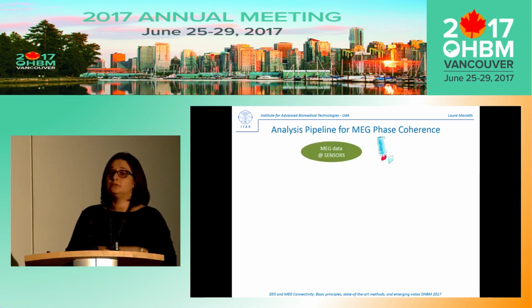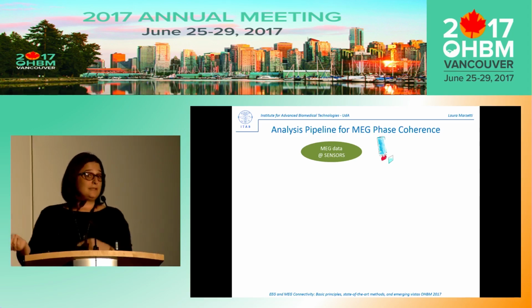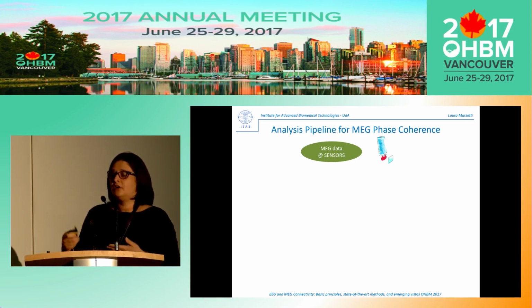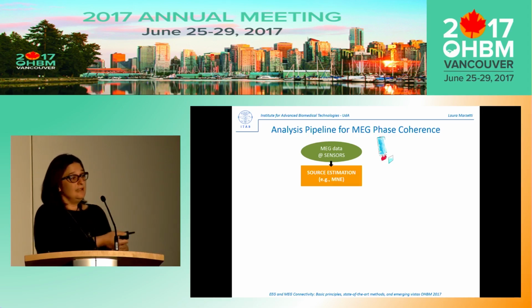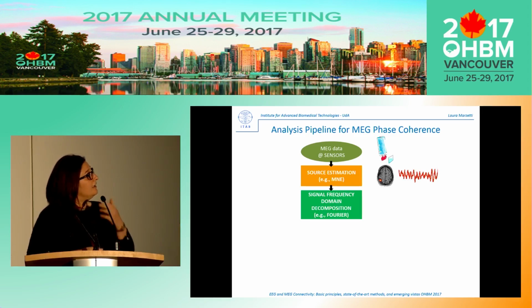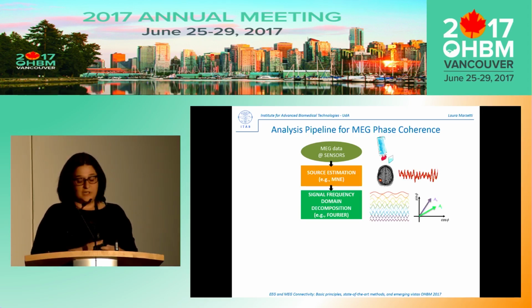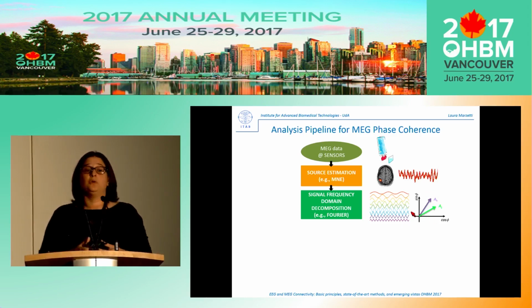Okay, now again, to wrap up this part of the story, if we now want to use our MEG data to do the other pipeline, and so to explore the intrinsic features of the high temporal structures of MEG data, then we still have to choose some inverse method. And then what we can do is to go directly, for instance, into the frequency domain. And this will give us a set of oscillations, which weighted will give us the full signal that we started with. We can represent this information in the way we have just done.